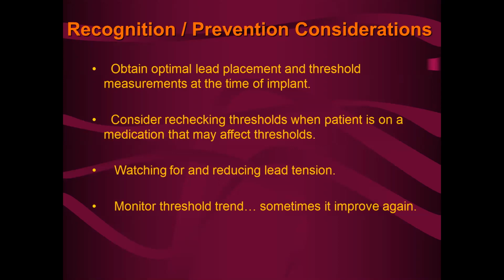You want to make sure that there's some sort of gentle loops or curves on the wire so that you don't create those kind of stress points that I showed you at the header of that X-ray. You don't want to create stress points that can lead to lead tension and cause the wire to break over time.